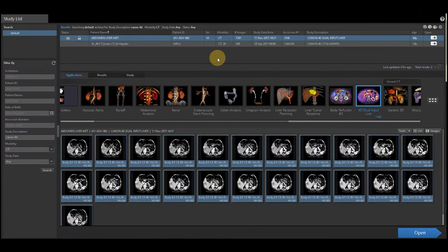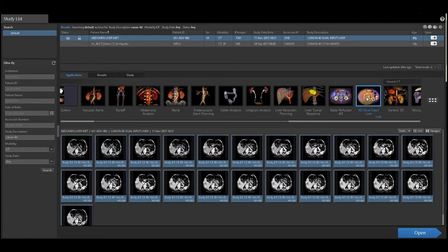This demonstration video is on our 4D dual input liver application. We do have a body perfusion 4D application used for any organ other than the liver or the lung. This video is going to focus on our liver perfusion application.